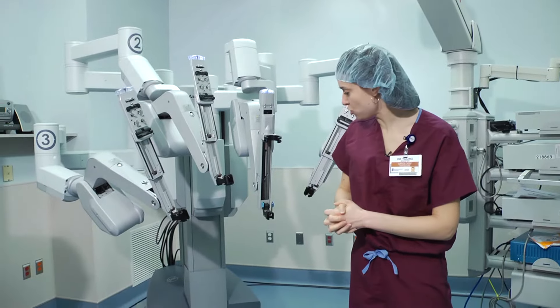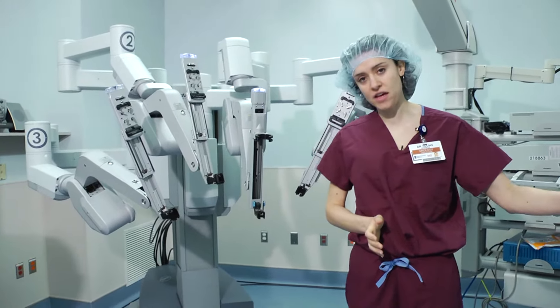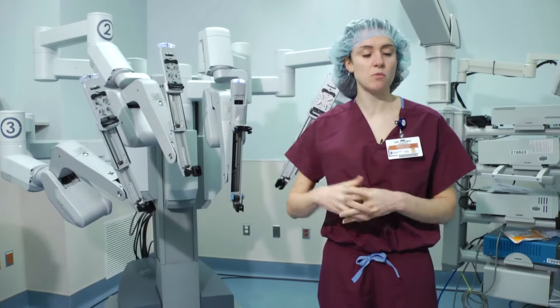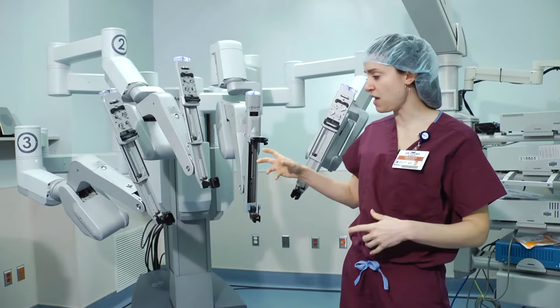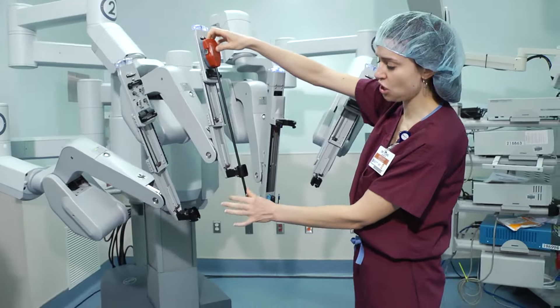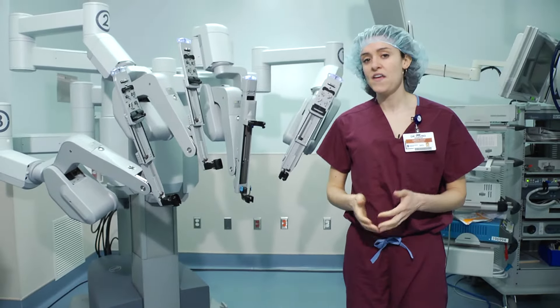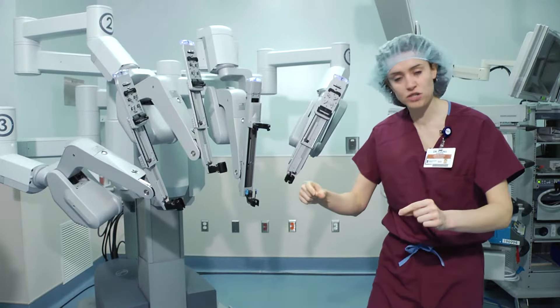That's how surgery works with da Vinci robotics. The patient is on the bed, we get them positioned however is necessary for that particular surgery, we bring the robot in, and ports go into the stomach. Through those ports, we have the instruments connected to the da Vinci arm. Once everything is clicked in place — what we refer to as docking the robot — the surgeon sits in the console in the corner.